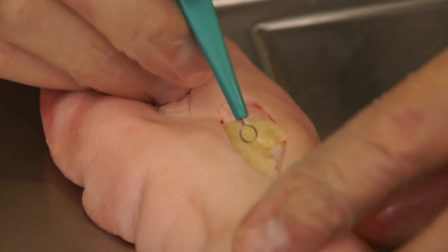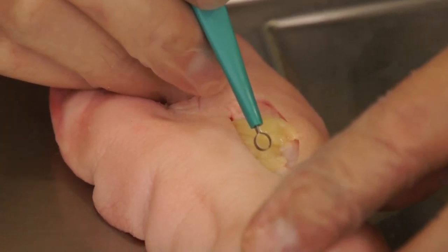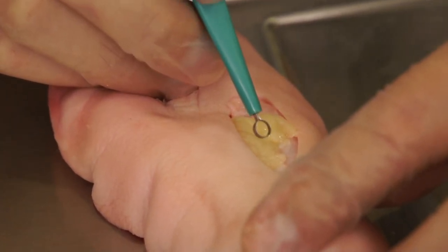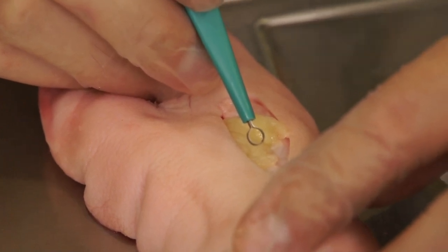In this demonstration we've used a pig foot and chicken fat to simulate a pressure ulcer with yellow necrosis. Initially, a dermal curette four millimeters has been selected.